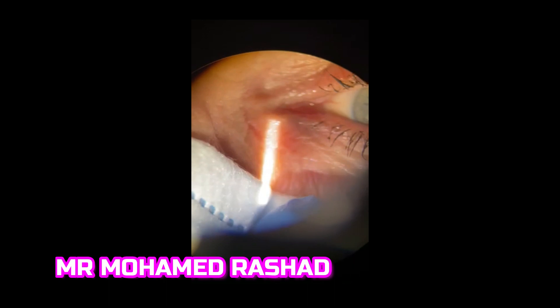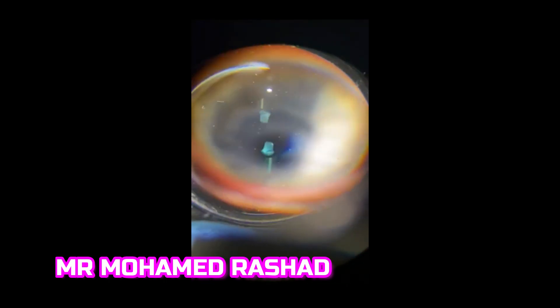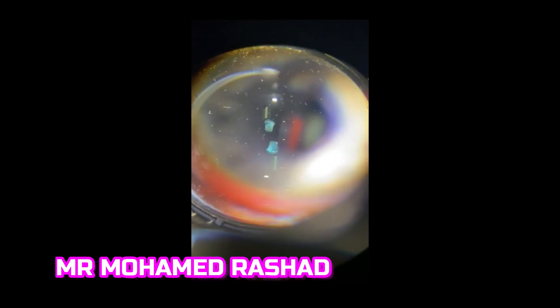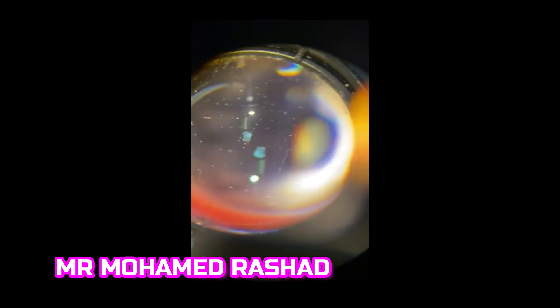This is the other eye — proper fitting of the mask leaving no gaps, and examining the optic disc clearly without any fogging.